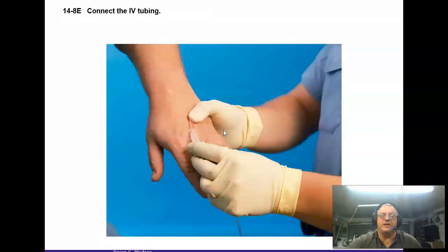And how to troubleshoot, by the way. You should be able to pull back and get blood out of an IV, okay? If you're not, I would severely doubt the patency of that line. Again, you're going to connect your IV tubing and then push the fluids in to see if you're in the right spot. Every now and then you are going to be sitting next to a valve, which won't allow you to draw blood, which is kind of a pain in the neck. But the point of that is, I can pretty much guarantee you if you're in a patent line with a 20 gauge, you're going to be able to draw blood out of it. It's pretty much a given. I'd say 98% of them you're able to do that with. But you got to make sure you're in the right spot and make sure to flush this line out.